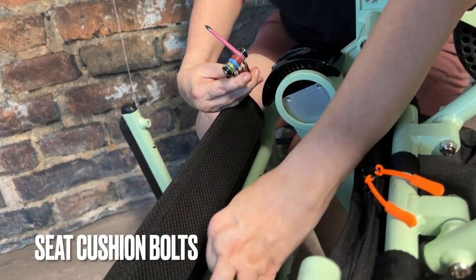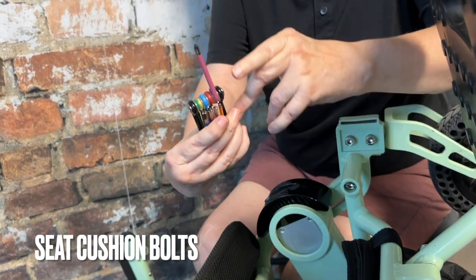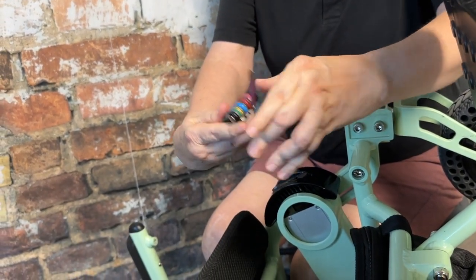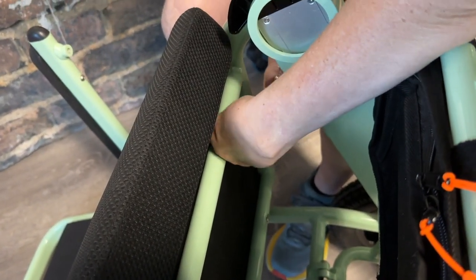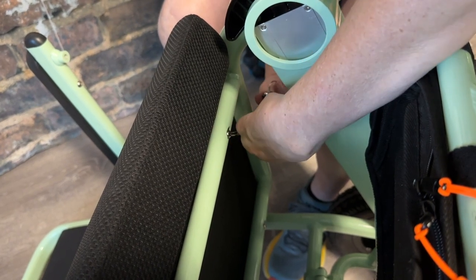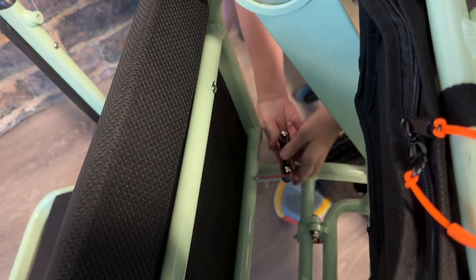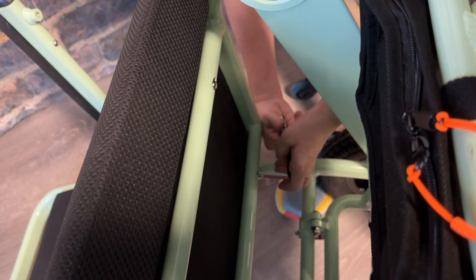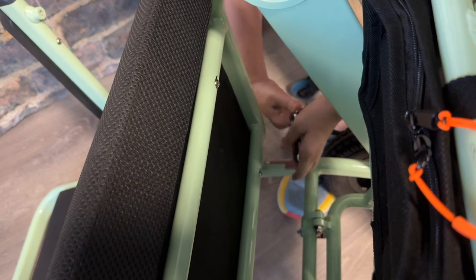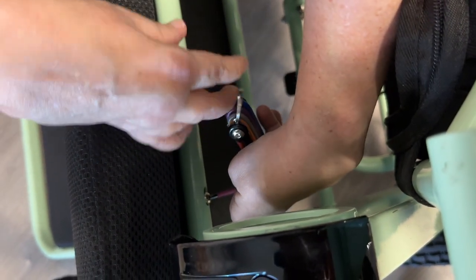With the chair still in the wheelie position, it's now time to tighten the four bolts that hold the seat cushion in place. We're going to grab the pink allen that has the Phillips head on it. As a factory, we do not glue these four bolts in place because a lot of our customers struggle from incontinence or little bathroom potty accidents, so you don't want these bolts glued in permanently if you need to remove the seat cushion to spot clean it.